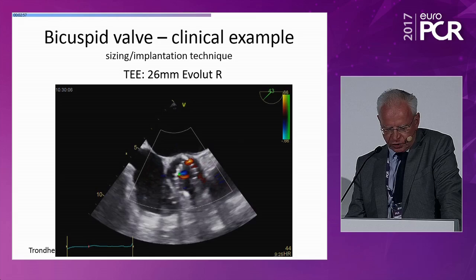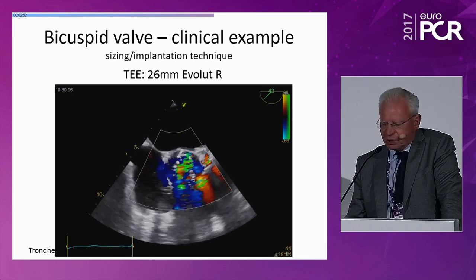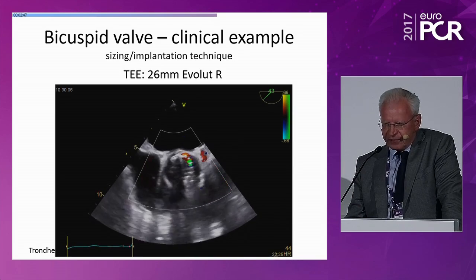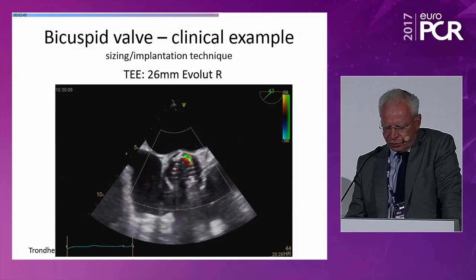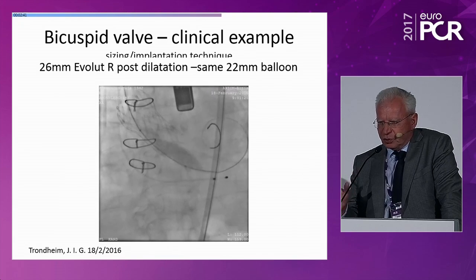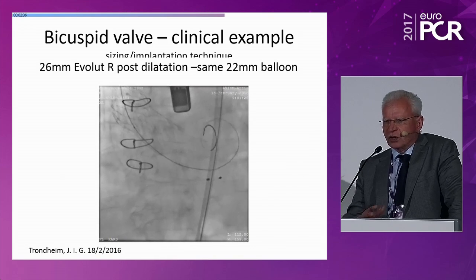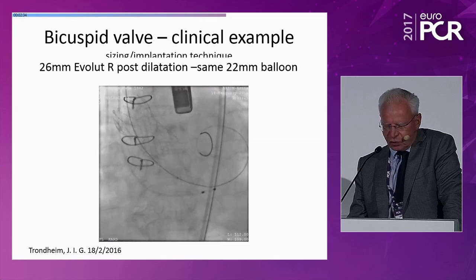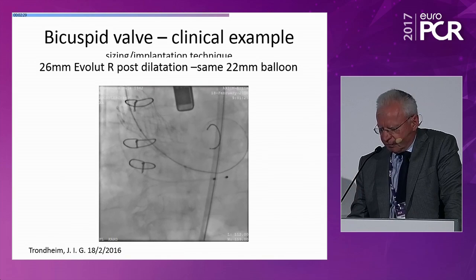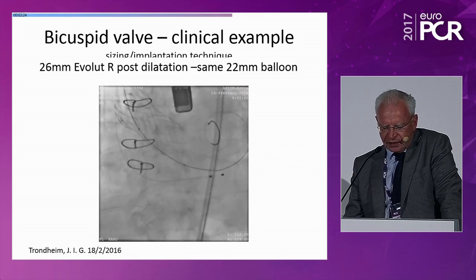and that is only one projection. You know, we should use two projections, and that is what you end up with during the procedure. You still have an elliptical valve at the inflow, and you do see some regurgitation. So in this kind of patients, maybe 40% of the patients, you do need a balloon post in order to expand the valve according to the given size. And the lesson is, don't upsize the balloon at this step. Use the same balloon which is proven to seal the annulus.